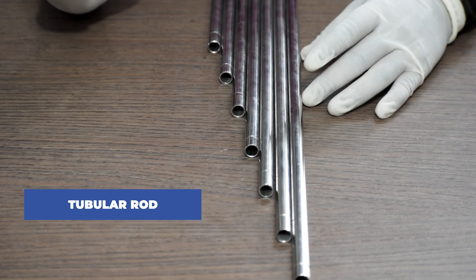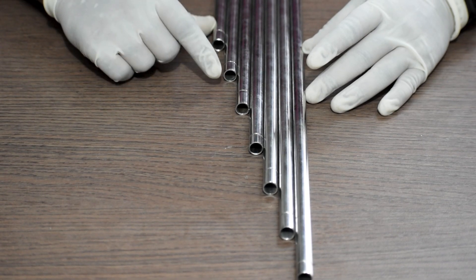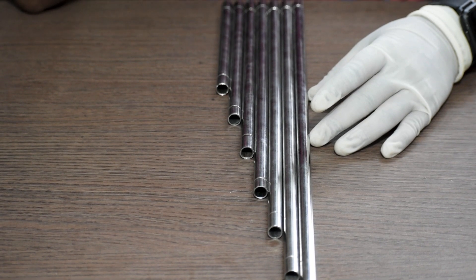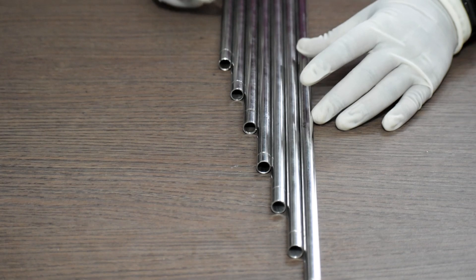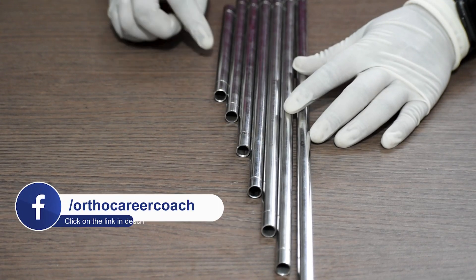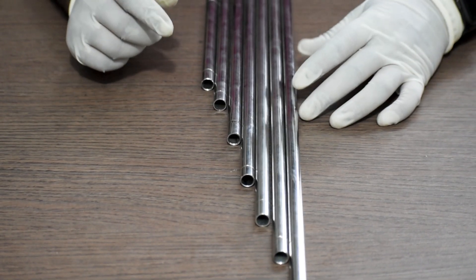This is the tubular rod. It is available in different sizes starting from 150mm up to 450mm in length: 150, 200, 250, 300, 350, 400, and 450mm — the difference between each length is 50mm. Usually, for humeral external fixator the length generally used is from 150 to 350mm, for tibia it's 150mm to 400mm, and for femur the lengths used are from 150 up to 400mm.